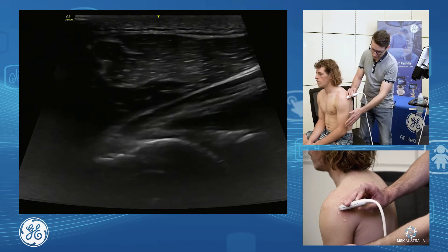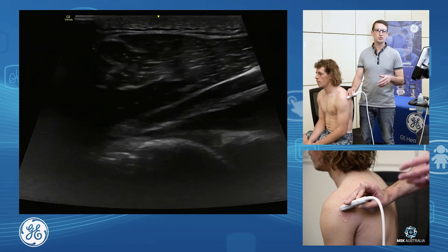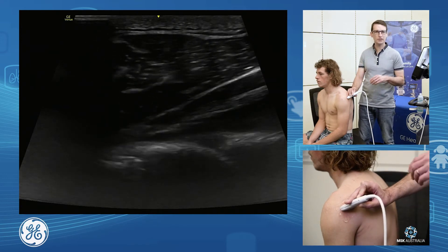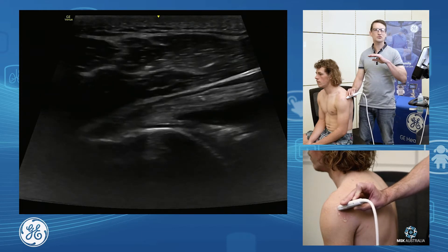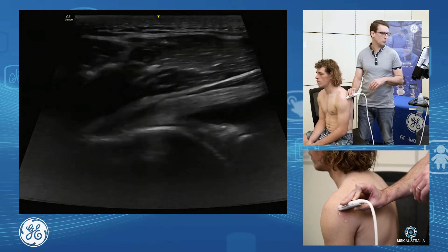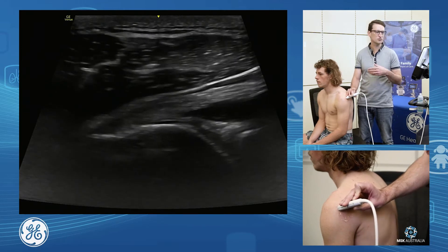I've got the hand in a really nice neutral position. If we reach the hand across the body, that will push and stretch those muscles across the back of the capsule and will push that joint fluid away. So we like to see this in a nice neutral position.